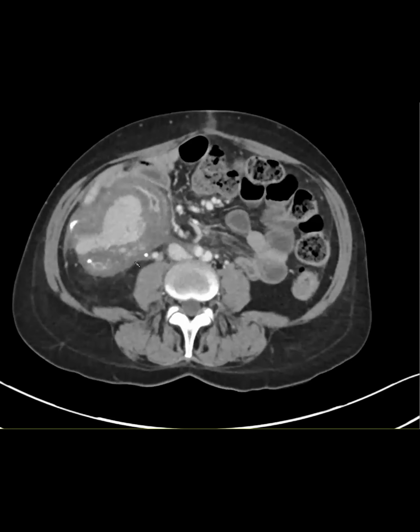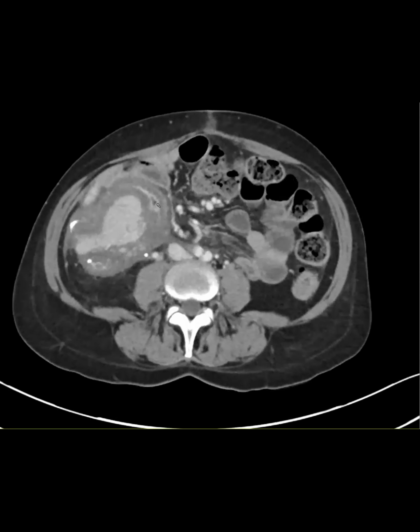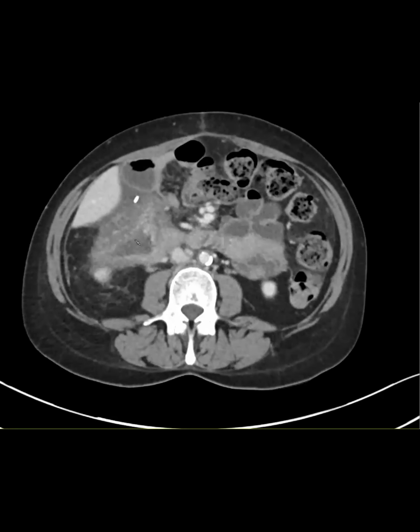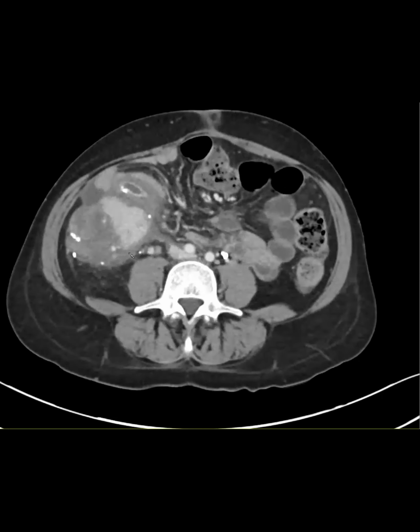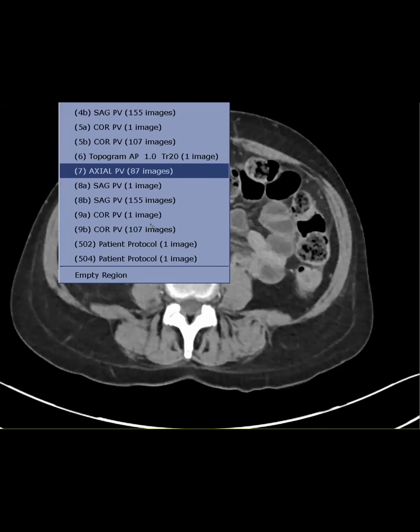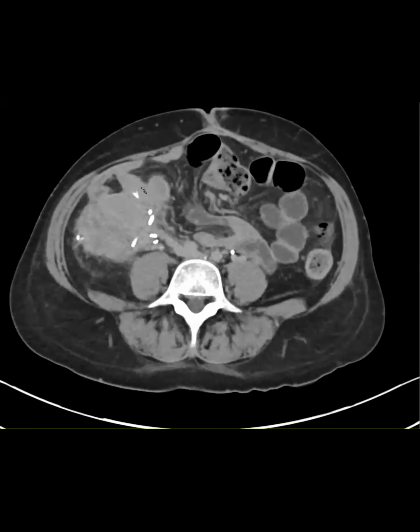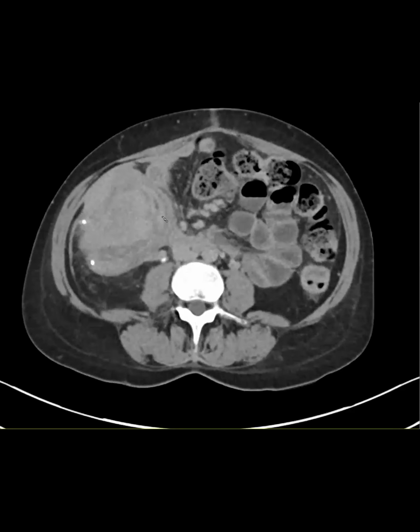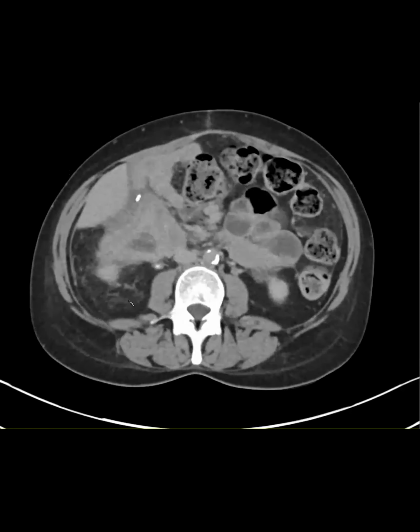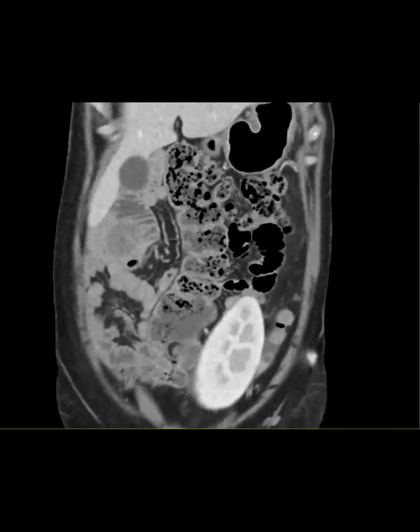Yeah, so that's basically what this case is about. This is the portal venous phase. You'll see the pancreas, and then this is the mucosa of the jejunal loop that's wrapped around it. And this is even part of that jejunum, fluid filled, wrapping around it. And this is the wall that's actually really edematous. And I'll go to a later phase. This confused me at first, I was like, why is all that fluid enhancing? Is it extravasating? But I think it's actually just the jejunal wall that's got some delayed enhancement in it. So this was a case of pancreatitis in a pancreas transplant.